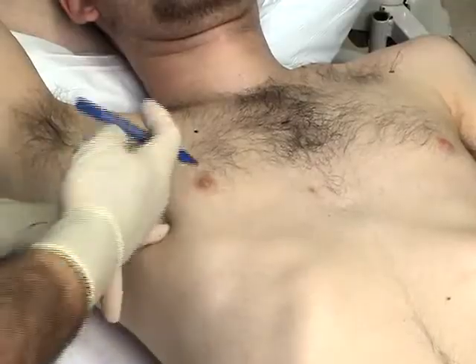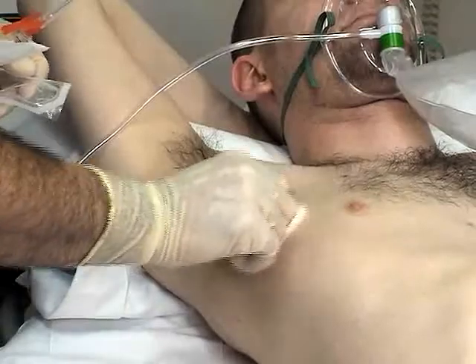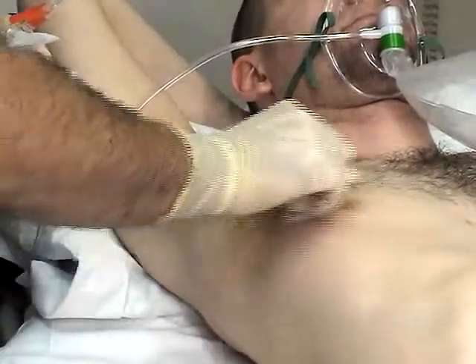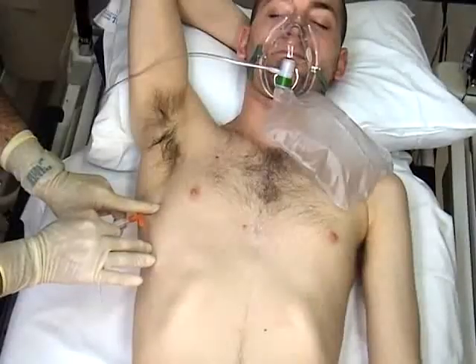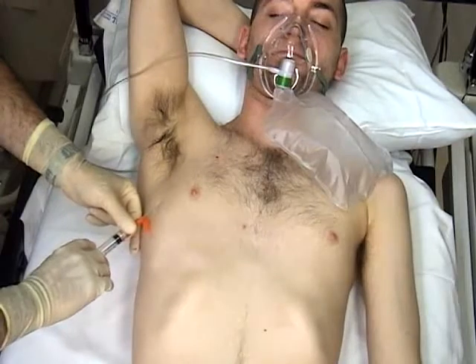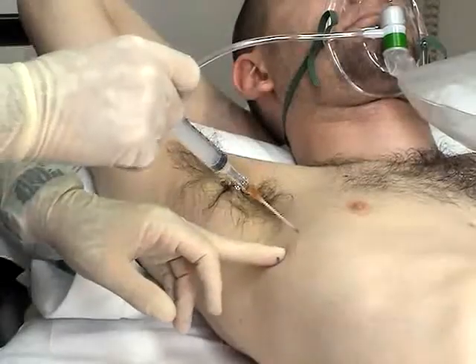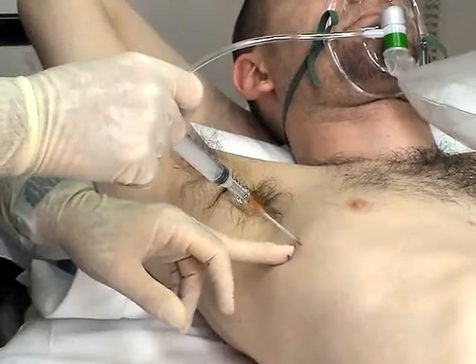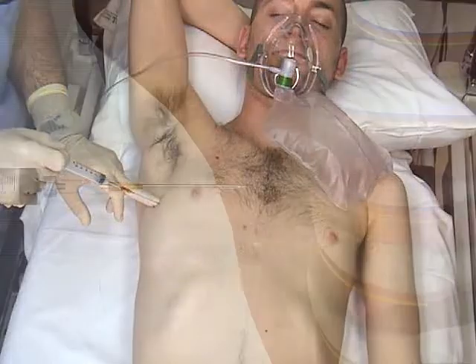Mark the insertion site with a skin marking pen if desired. Prepare the site with a skin cleansing agent such as chlorhexidine or povidone iodine. Local anesthesia of the area is optional and should be considered in the stable, awake patient. Insert the catheter assembly perpendicular to the skin along the superior surface of the fifth or sixth rib.